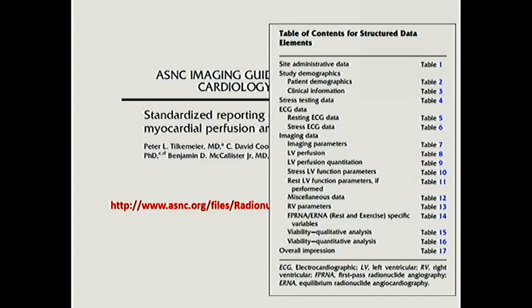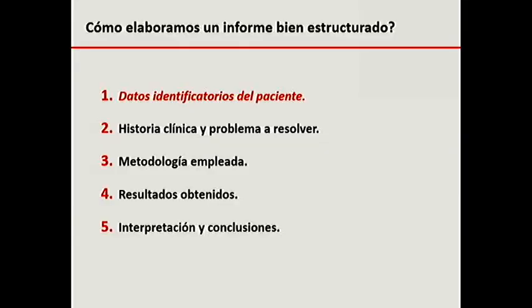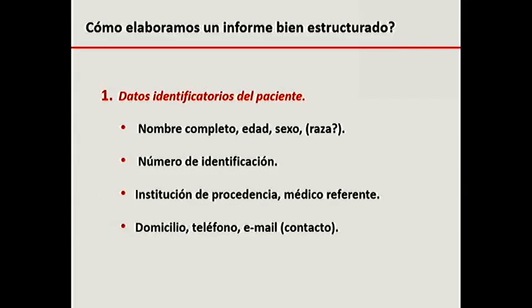And here we have all the steps to be taken. This is included in the literature. Here we also have publications of atomic energy, which were prepared with this purpose in mind. And the identification data of the patient, of course, we already know about this, but this part is very important, to be able to locate the patient, or a way to be able to contact the patient afterwards, because of many reasons.